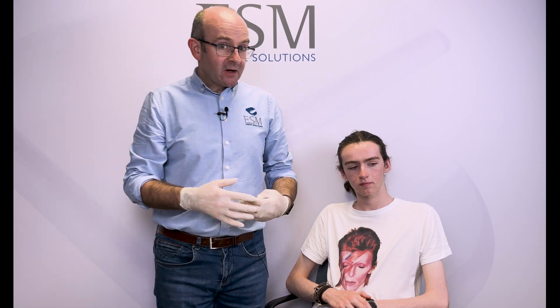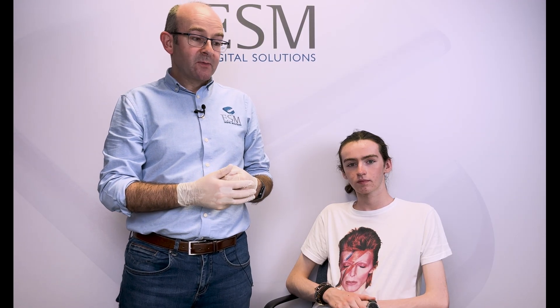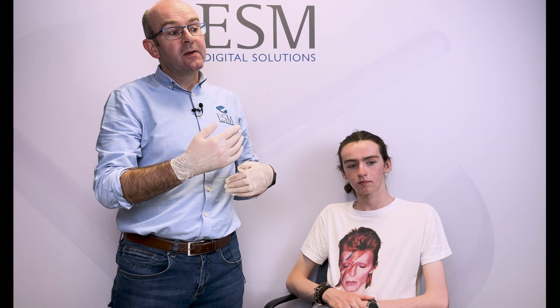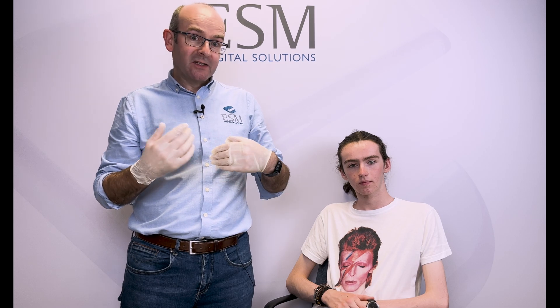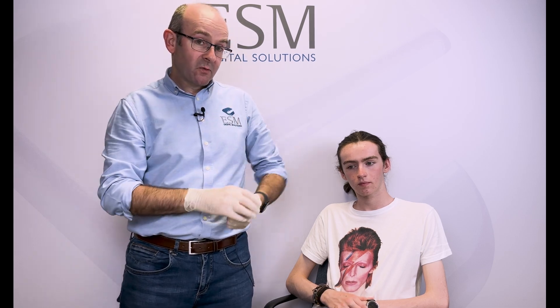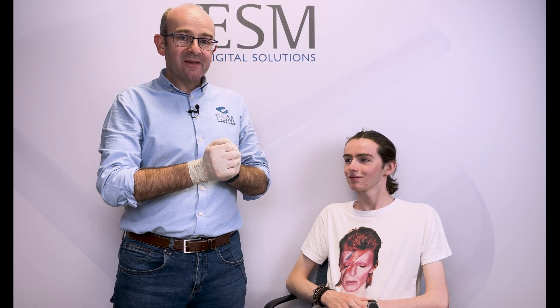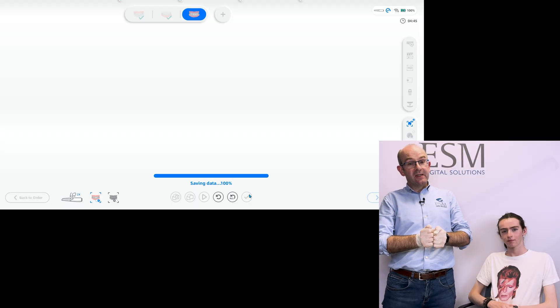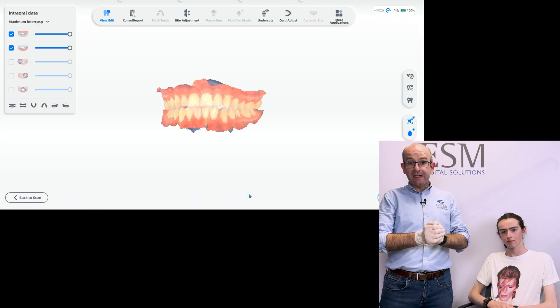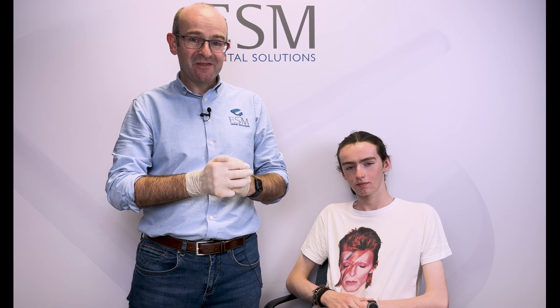This is a basic scanning strategy — in this case we have full seven-to-seven arches on the upper and lower with no edentulous spans, but the technique applies in all situations. If there is an edentulous span, we may need to revisit that area to capture interproximal surfaces. Thank you Tom for being our model today. If you have any questions or need support, please contact our team at support@esmdigitalsolutions.com. Thank you and goodbye.